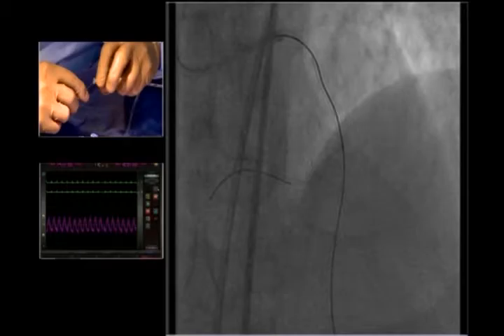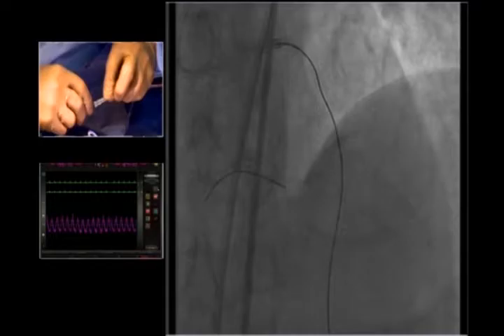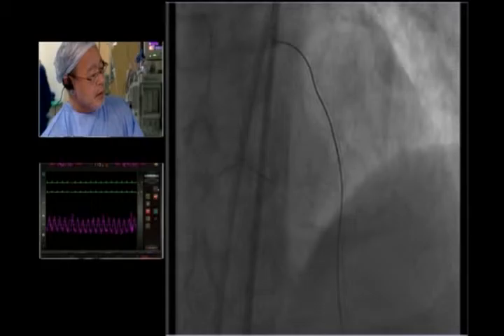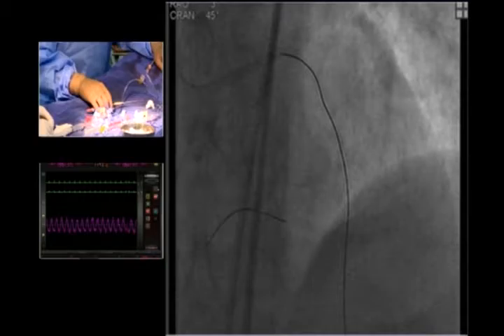So we're going to continue to stay with you for another 5 minutes or so, Dr. Saito. This is a very good teaching case. Okay. Thank you. It's completely trapped. And you're going to clockwise rotate to remove, correct? I'm applying. Yes, that's right. Good. But still. But maybe you can change your wire now, get a little more extra support wire.